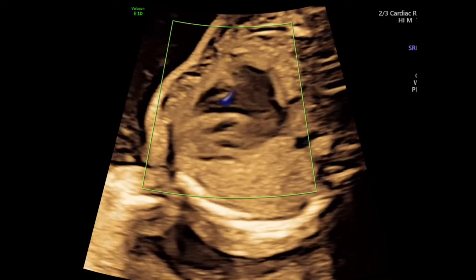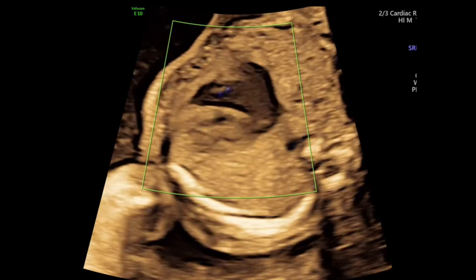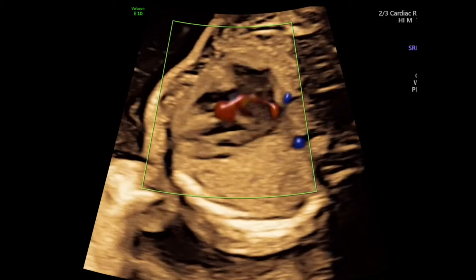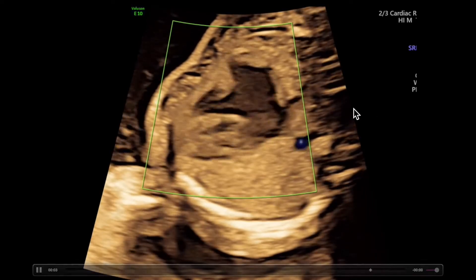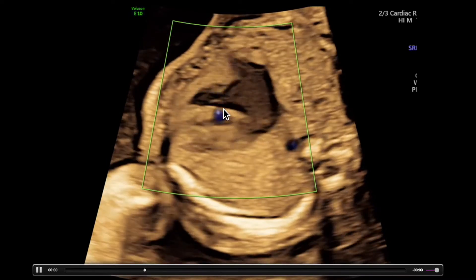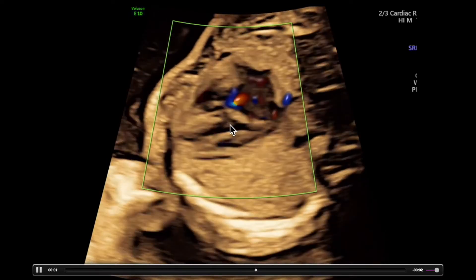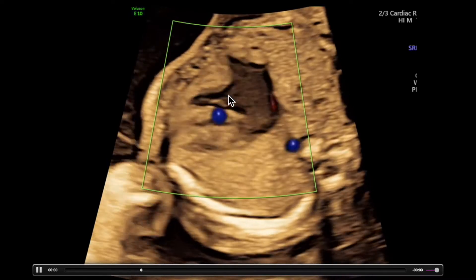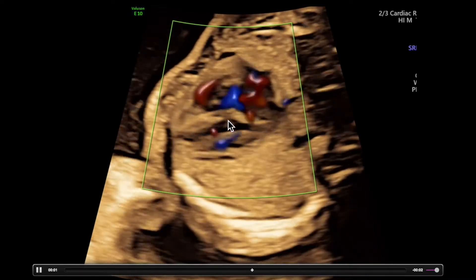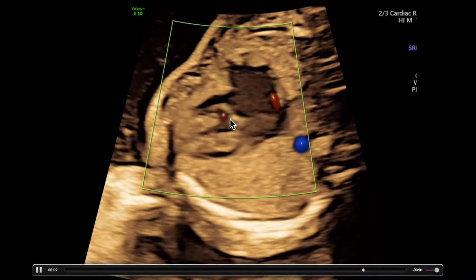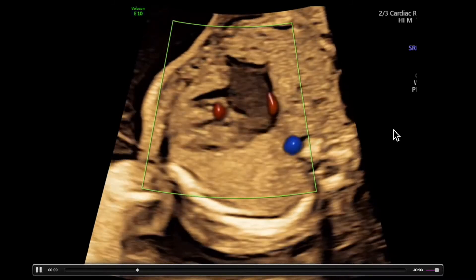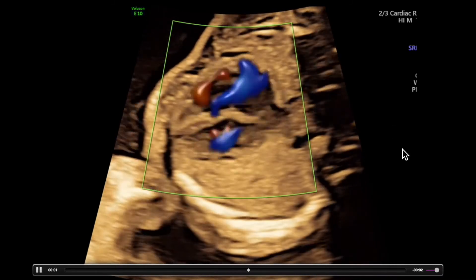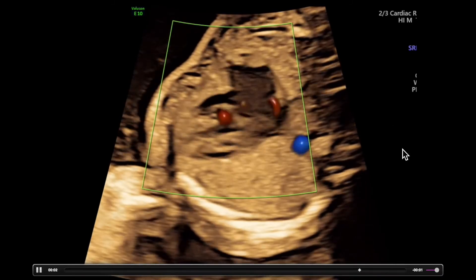To convince yourself that something is real as opposed to just drop-out, you need to turn your heart towards the side. Here we see an inlet VSD right at the level of the AV valves, just below the atrioventricular septum.